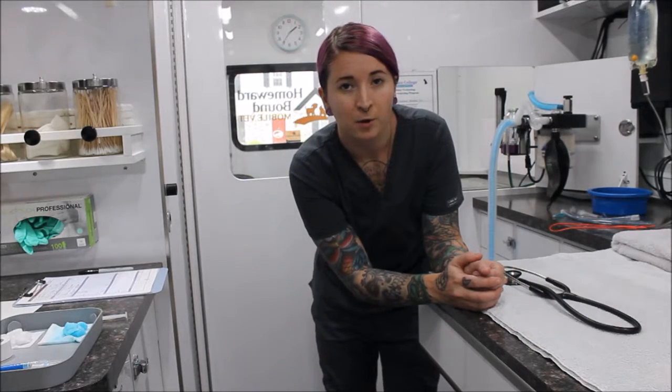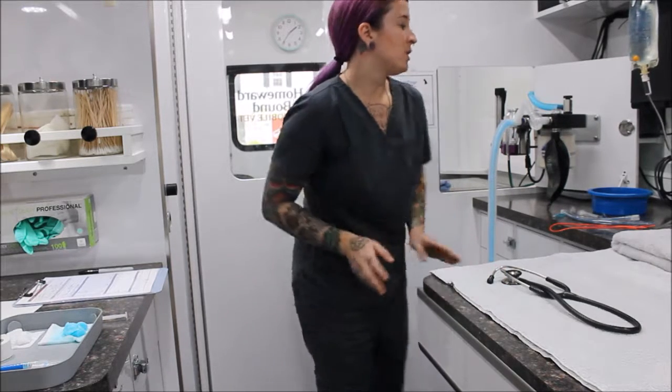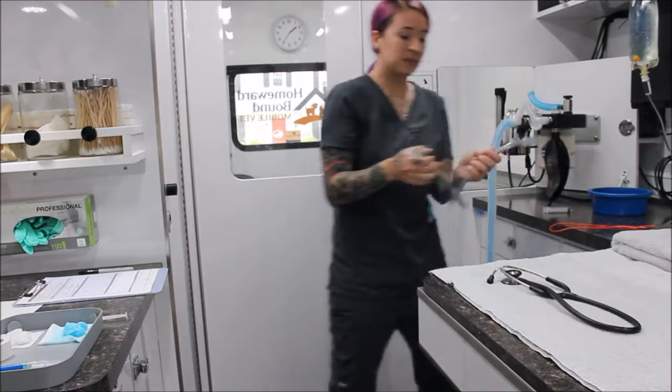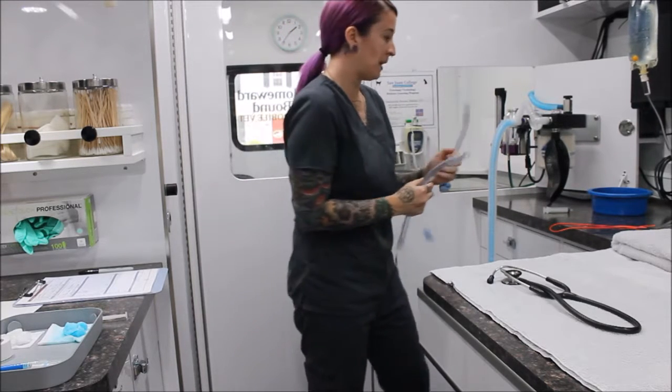So for this video, I'm going to gather the equipment and supplies needed prior to anesthetic induction. So the first thing I'm going to check to make sure that I have are 2 appropriate sized endotracheal tubes for my patient. I have a 10 and an 11, both are appropriate sizes for my patient.